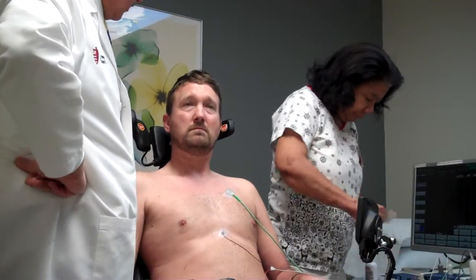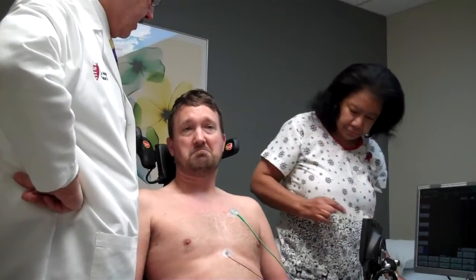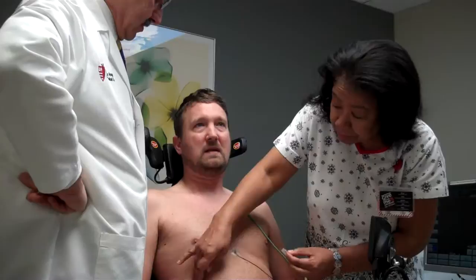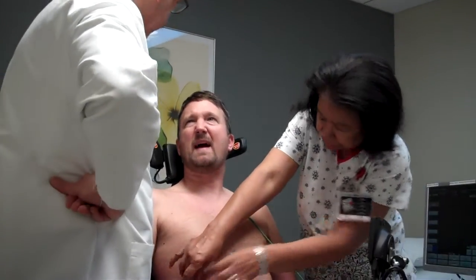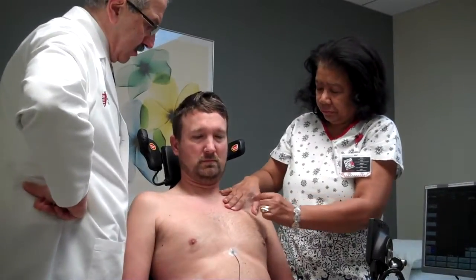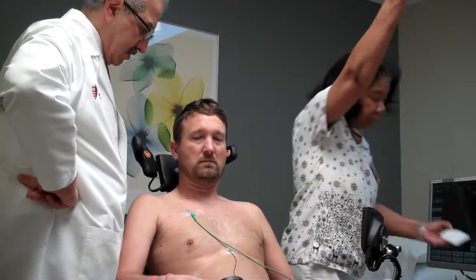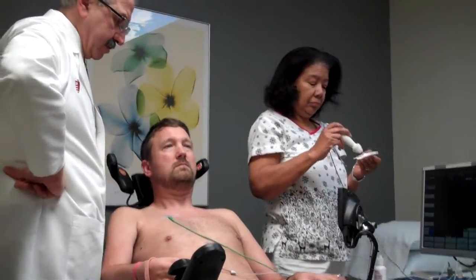But he can lie flat no problem? I sleep side to side. I don't like lying like that because it kind of hurts my back a little bit. Let's have you tilt, and then once you're done we'll turn it off.